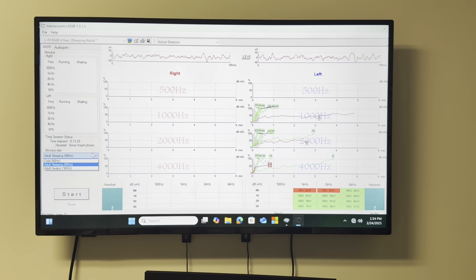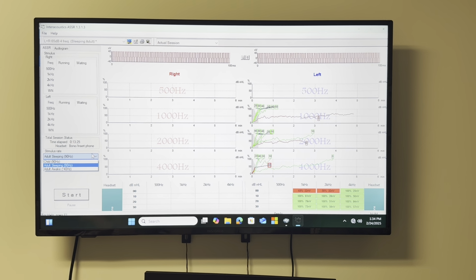But the argument is that the 40 hertz ASSR is affected by different stages of sleep. The amplitude changes. So you can do a test-retest reliability of 40 hertz in normal hearing individuals, asleep versus awake, in the same session. If you're done, do one more time and compare between sessions. If it is replicable, then even though historically it's believed that you have to be awake, you can get a reliable response when they're asleep. Just providing some evidence for that.